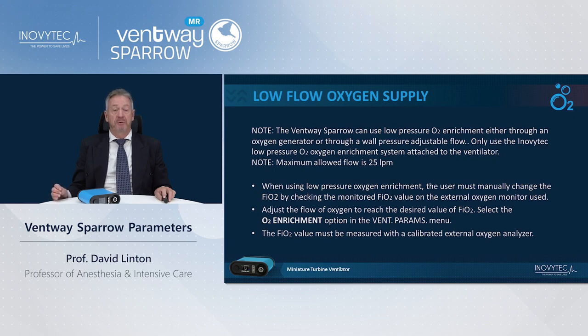I find that a pulse oximeter indication is enough control and backup to monitor whether the oxygen that you're delivering is enough through the low flow system.